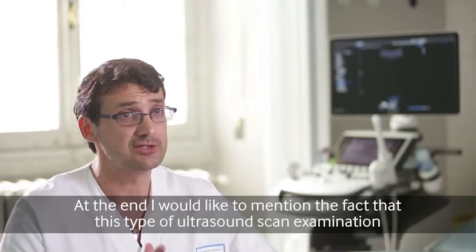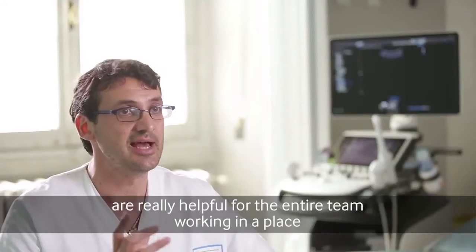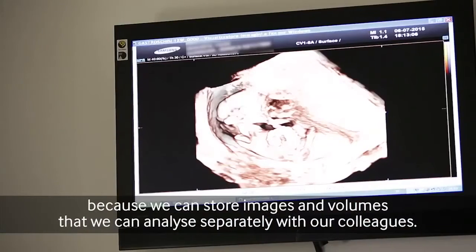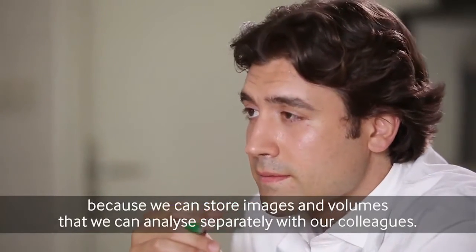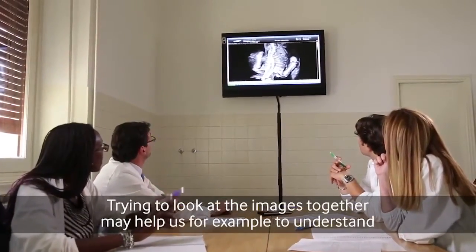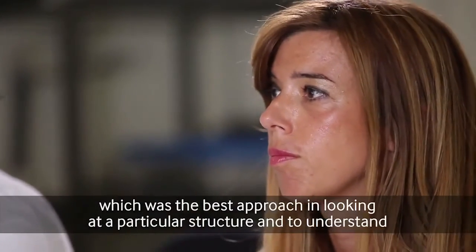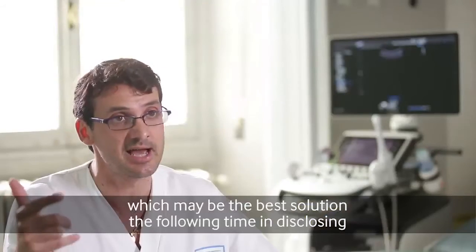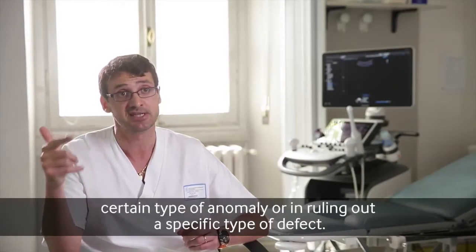At the end, I would like to mention that this type of ultrasound scan examination is really helpful for the entire team working in a place, because we can store images and volumes that we can analyze separately with our colleagues, and try to look at the images together. This may help us, for example, to understand the best approach in looking at a particular structure, and to understand which may be the best solution the following time in disclosing a certain type of anomaly or in ruling out a specific type of defect.